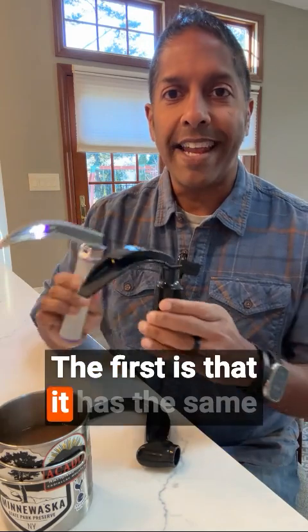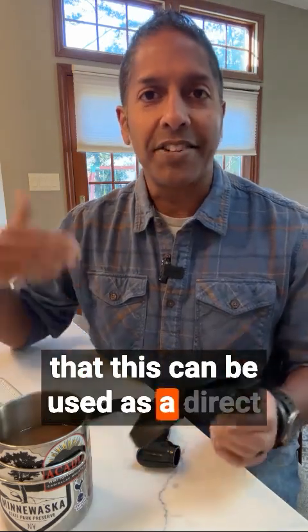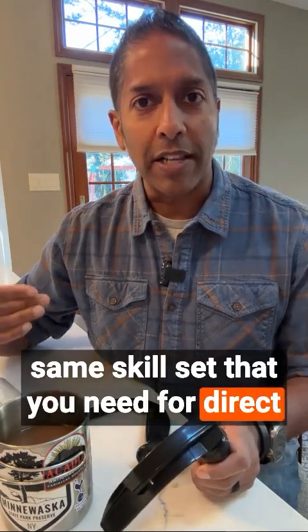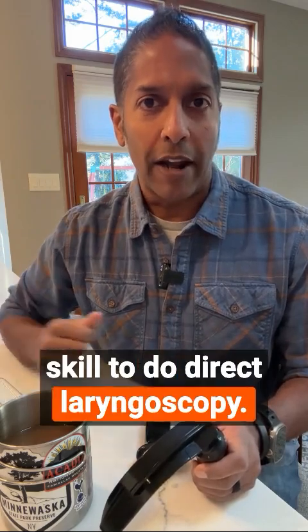The first is that it has the same geometry as our old school direct laryngoscopes, which means that this can be used as a direct laryngoscope and you are creating the same skill set that you need for direct laryngoscopy. So if there's a technical issue with your video system, you still have the skill to do direct laryngoscopy.